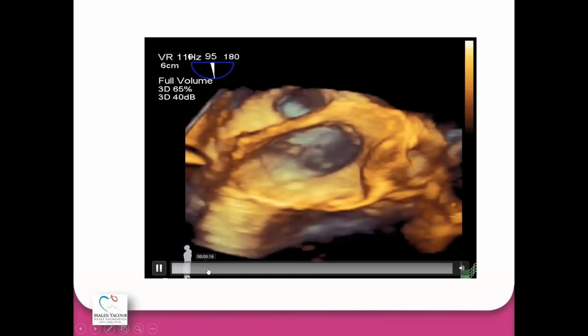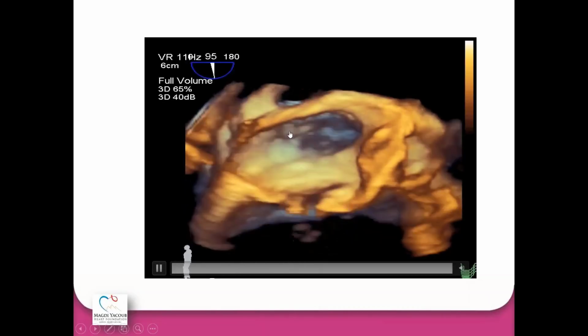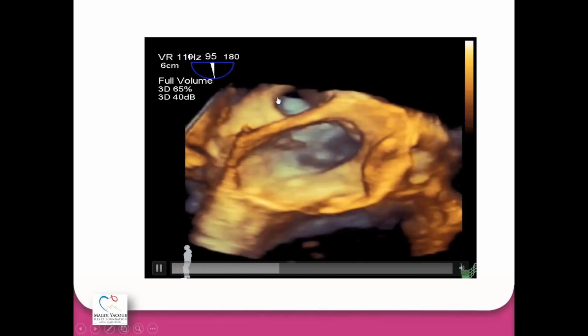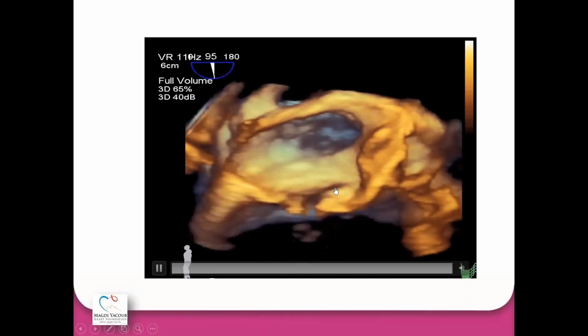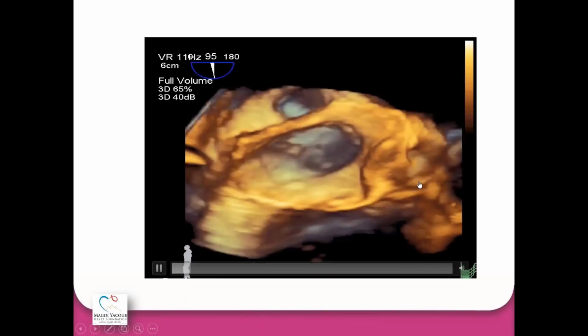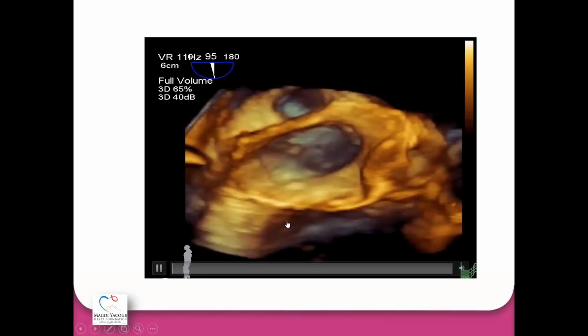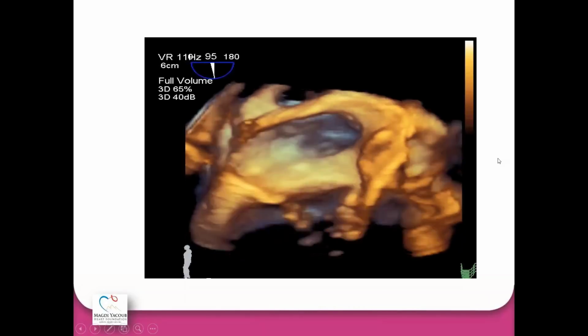Here's the 3D volume for the left atrial appendage ostium. You can see it is more or less oval. It is not a circle. This is the Coumadin ridge. This is the left upper pulmonary vein. Anterolateral commissure of the mitral valve. This is A1 and this is P1, and here's the aortic valve. It looks like a long axis view. The aortic valve, aorta is here, mitral is here, with some depth behind.